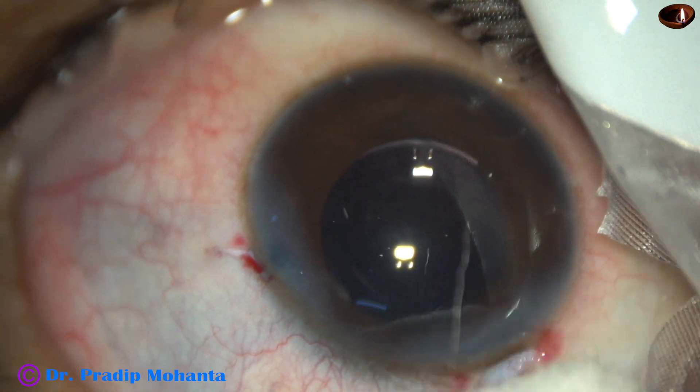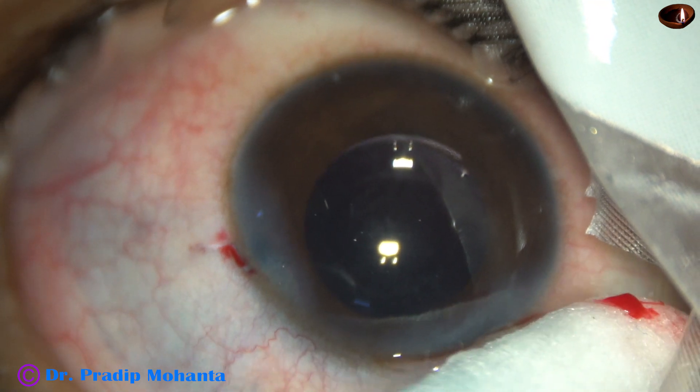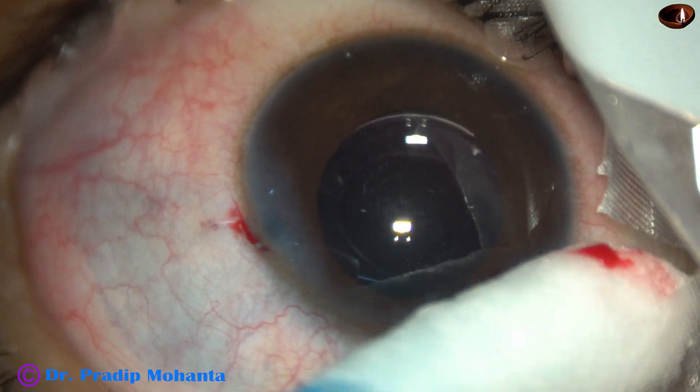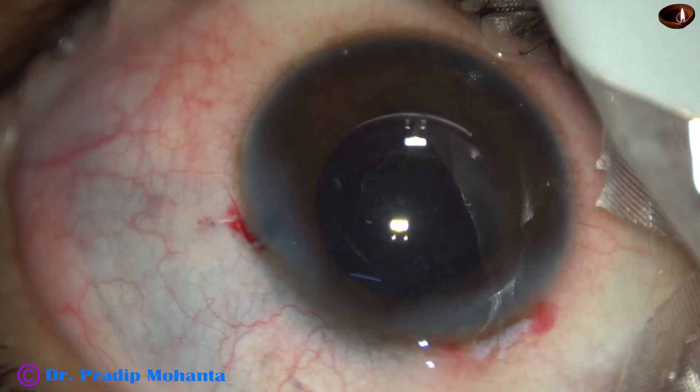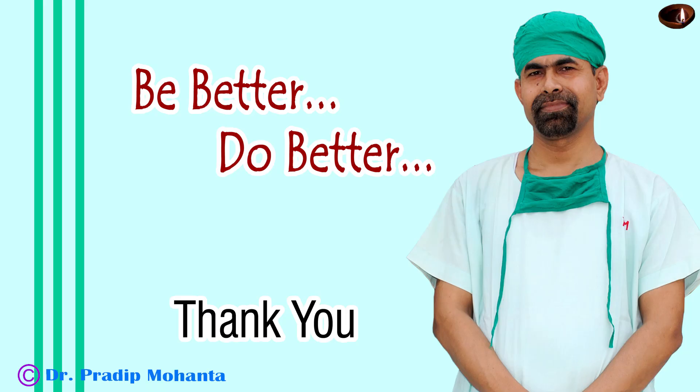There is no leakage from any side. I saw this patient post-op and the patient was doing very well. We can see the posterior vitrectorexis very nicely in this picture. Thank you very much for your attention. Hope this video will help you in developing your surgical skills. The message in this video is: vitrectorexis is easier and much better than posterior capsulorexis by utrata forceps.